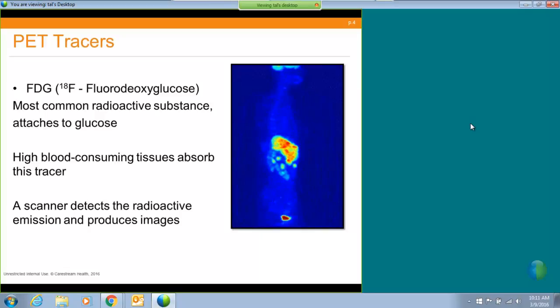And since it is highlighted and we can image it from the outside, we can see which are those tissues that absorb it. And basically, talking about cancer and tumors, a tumor is something that absorbs more than the other tissues around, and so the imaging technique gives us a pretty good image of what's going on functionally inside the body.